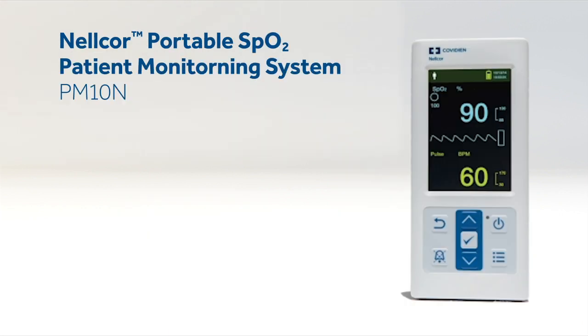The Nellcor Portable SpO2 Patient Monitoring System is part of the total solution for respiratory function monitoring. The PM10N provides clinicians with critical features in a handheld monitor at an economical price. For accurate, reliable SpO2 measurements, count on the Nellcor Portable SpO2 Patient Monitoring System.